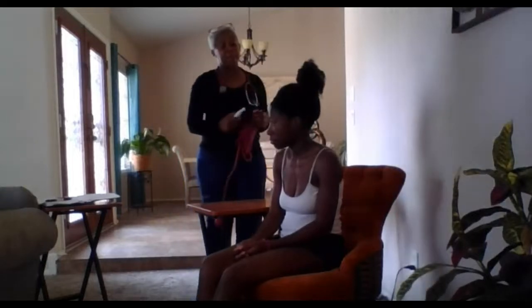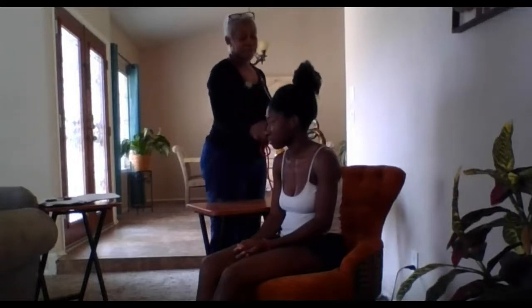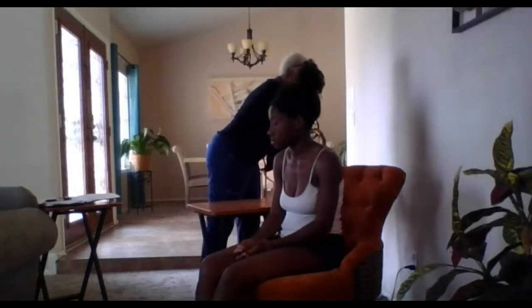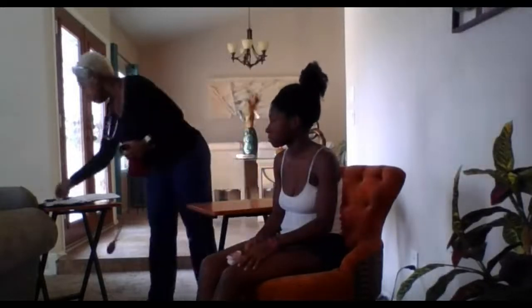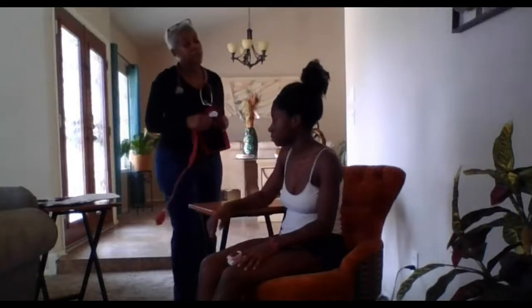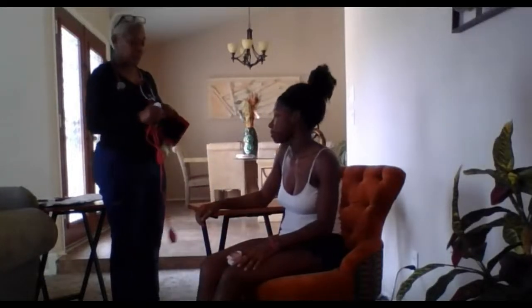I'm going to start out by taking your temporal temperature. Your temperature is 97.9. Let's put this on. Let's check your oxygen level. And that'll give us your pulse as well. Do you have a specific arm you want me to check your blood pressure in? All right. Okay.